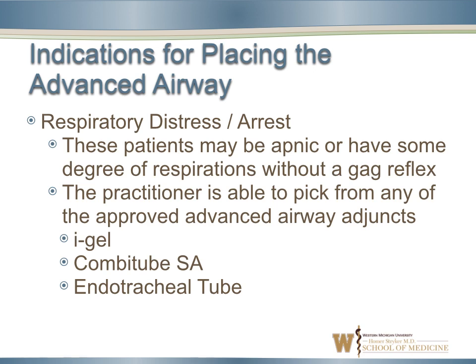Patients in respiratory distress or respiratory arrest, which include patients who are apneic or have some degree of respirations but clearly without a gag reflex, the practitioner is able to pick from any of the approved advanced airway adjuncts. That includes the Combitube SA or the iGel or endotracheal tubes.